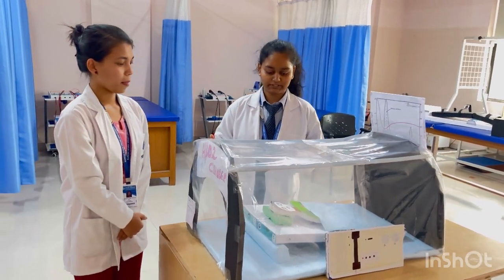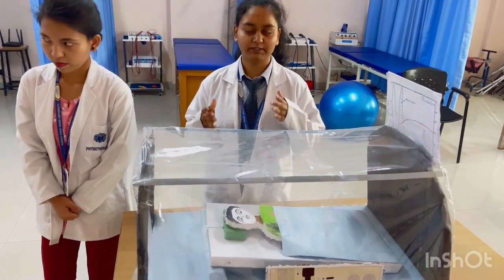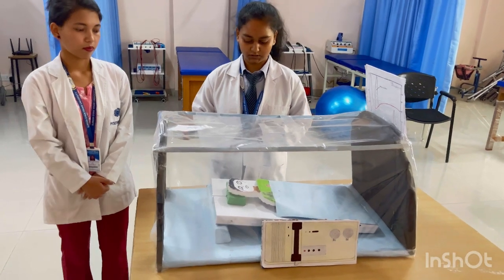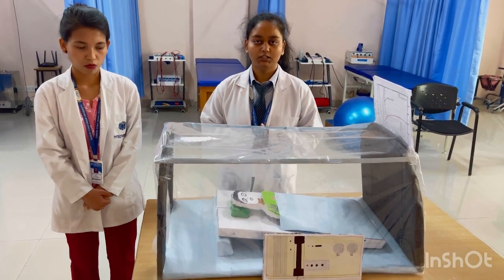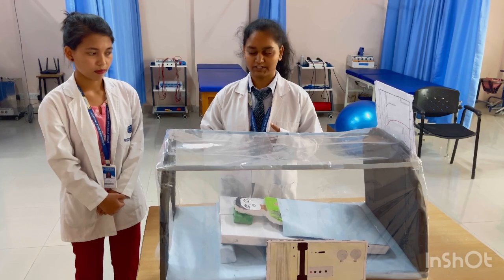Before sending the patient to this HBO2 chamber, we first have to assess whether the patient meets the requirements to receive the treatment. So we will take the vital signs: temperature, heart rate, respiratory rate.